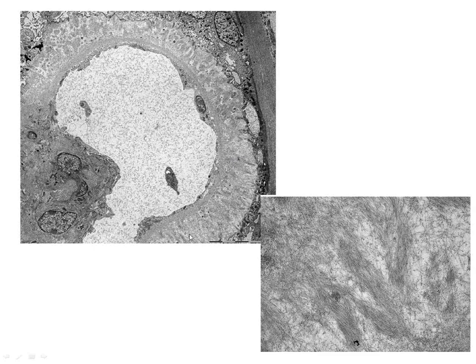But our IF for this case didn't actually support it, because you would expect to see very strong staining with the lambda or the kappa, depending on what amyloid it was, and we didn't see it on this case. So even though we had that discussion when we first looked at that case, and I think I even mentioned it in the biopsy report when I wrote it up, having spent a year and a half at UNC, I think that our IF didn't support it. So that's kind of how I feel about that. Does that help you? Mm-hmm.